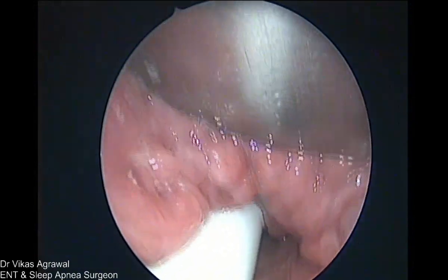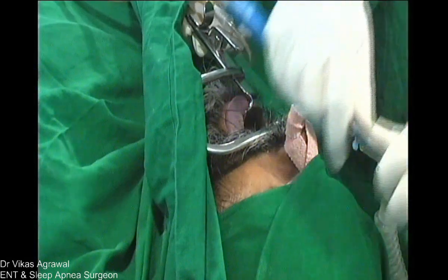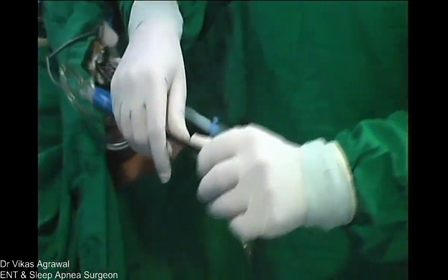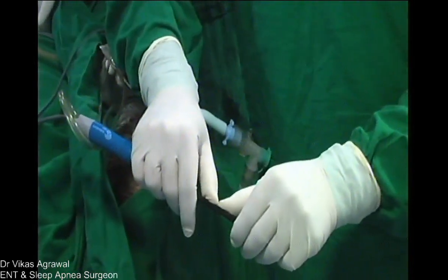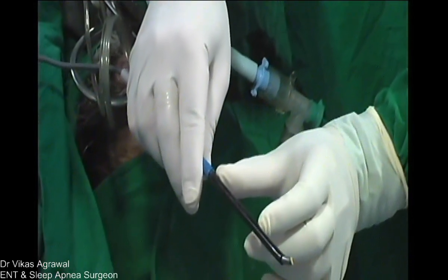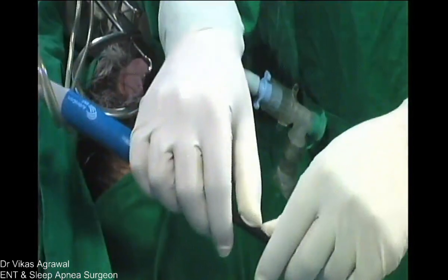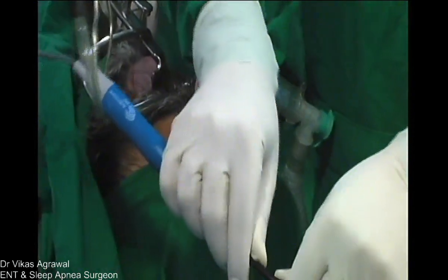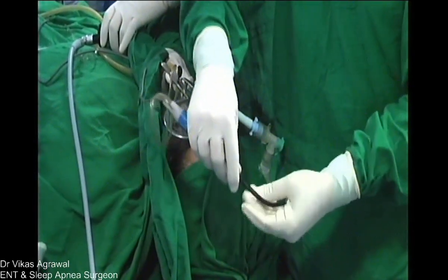So what we need to do is show from outside. Sunil, 9 and 4. Now what I'm doing is, since I have to reach the vallecula, I have to bend the wand. Bending of the wand should be done at the junction of the proximal 2/3 and the distal 1/3. There you have to bend the wand, but in a gentle curve. You can't bend the wand at an acute angle.